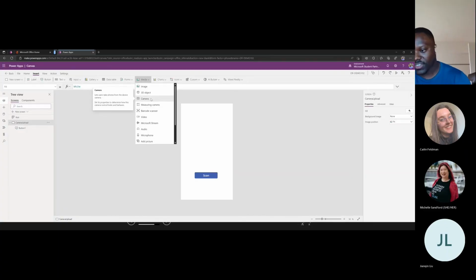There's camera. So part of this actually involved using a camera, because ideally, how you diagnose DR is by using a camera. It's called a fundoscope. And so the radiographer would have this camera within this device, and then they actually look at the retina of the eye. So this camera can be then, you use this service, then connect it to your fundoscope for the professional, and then they can actually capture the image, and then send it to the model, and then get a result.